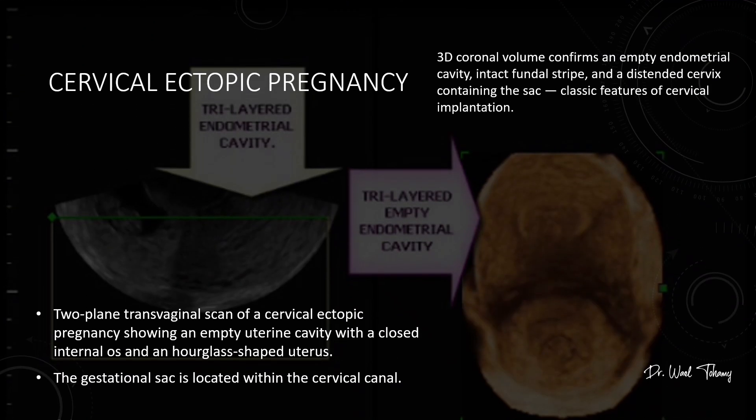Now let's look at a cervical ectopic pregnancy. On this two-plane transvaginal scan, you can see the uterine cavity is empty and the internal os is closed, giving the uterus that classic hourglass shape. A low-lying gestational sac is sitting right within the cervical canal. Recognizing this location early is critical because cervical ectopics carry a high risk of severe bleeding if not managed promptly.